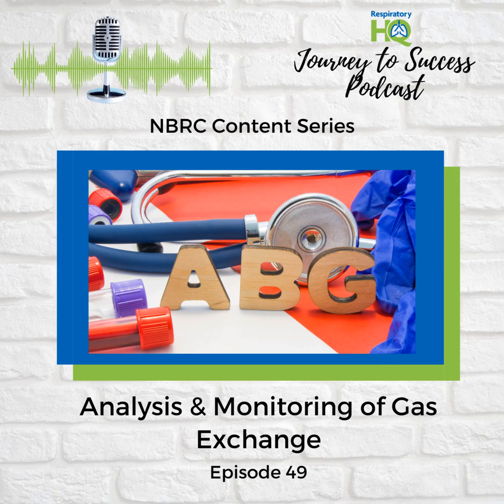Absolutely. And speaking of monitoring, we can't forget about capnometry. Okay, another new word. What is capnometry, and how does it fit into all of this? Well, capnometry is all about measuring carbon dioxide. But instead of looking at the blood, we're analyzing the breath. Remember how we talked about CO2 being a waste product of our metabolism? Yeah. Well, when we exhale, we get rid of that CO2. So capnometry is like a breathalyzer for CO2.